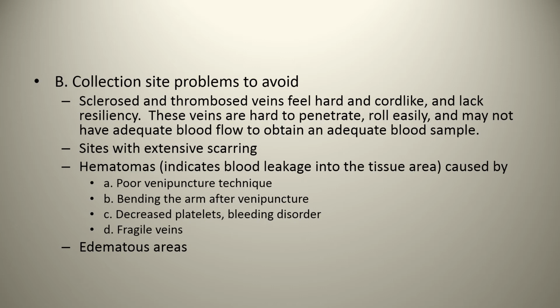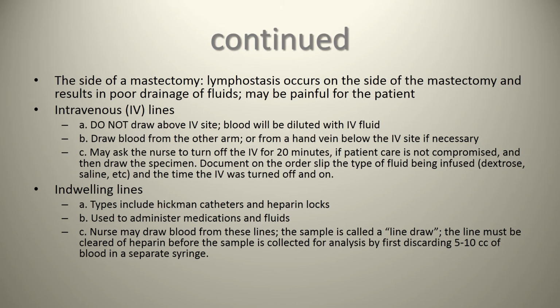The site of a mastectomy, as mentioned before, is also to be avoided. IV lines are also a complicated area to draw blood from. And finally, indwelling lines are also a complicated area. And once again, you should probably have more extensive skill in phlebotomy, not just an online YouTube video, to access these techniques. So, inserting the needle and collecting the blood.